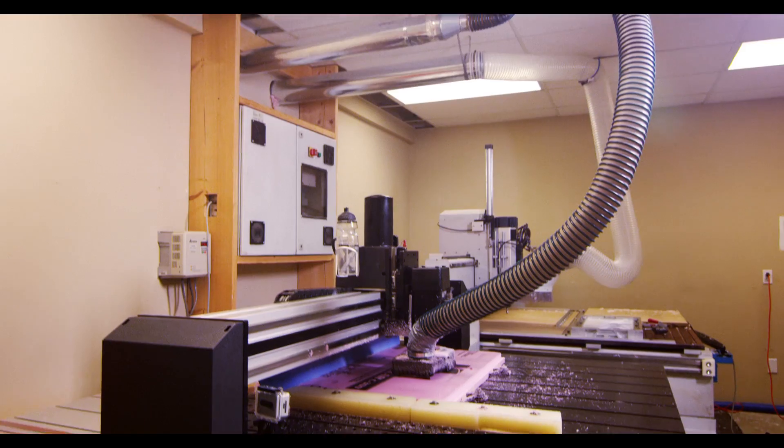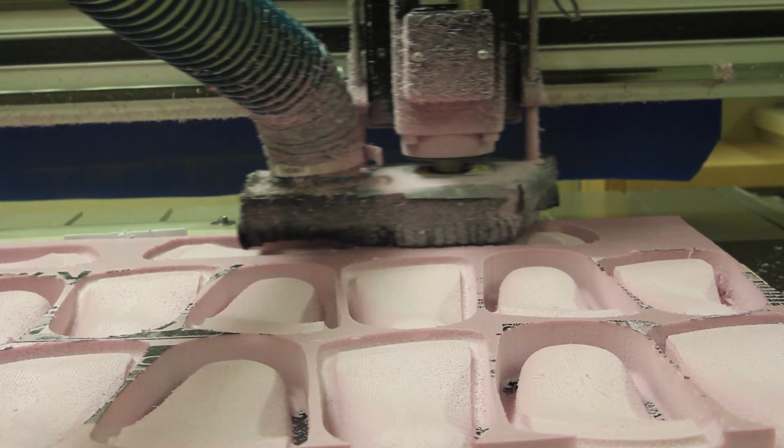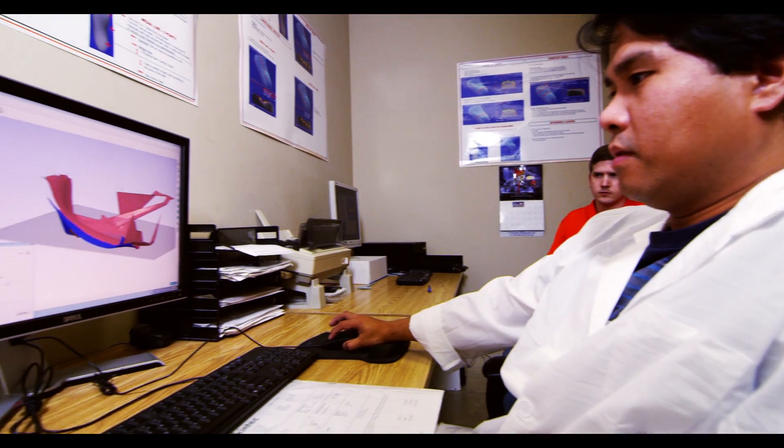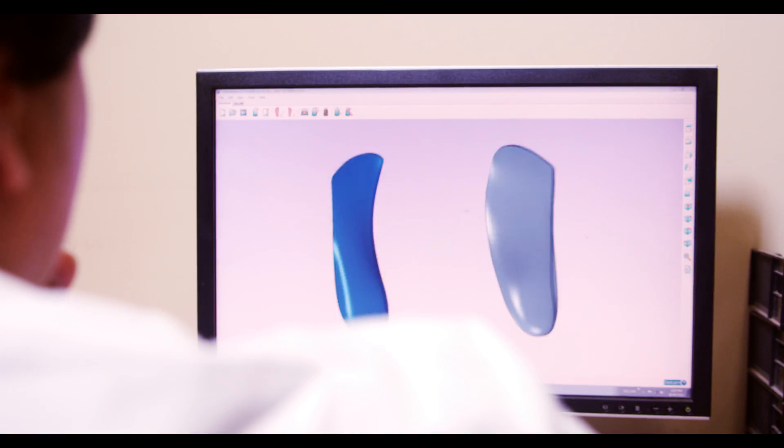For some orders, this foot shape is then machined to produce a physical model of your actual foot. The orthotic will later be formed around this model ensuring a custom fit.